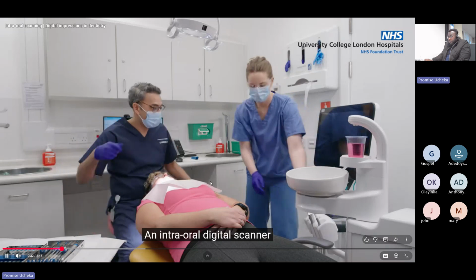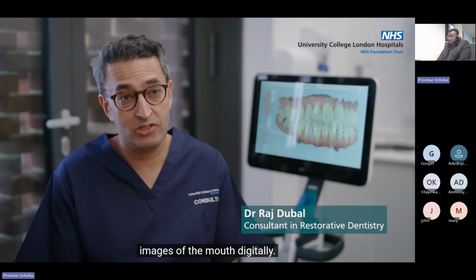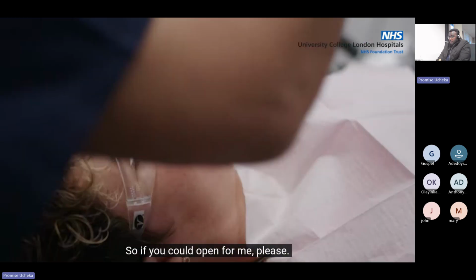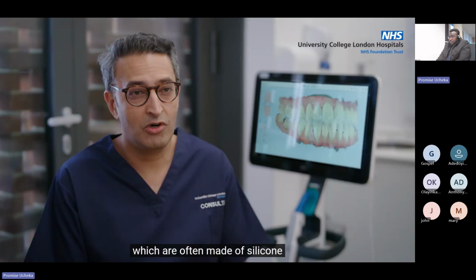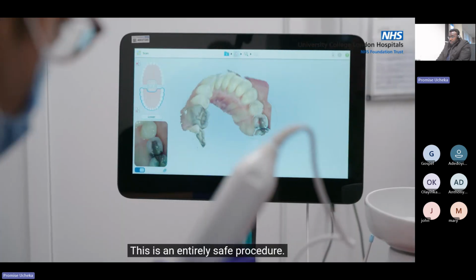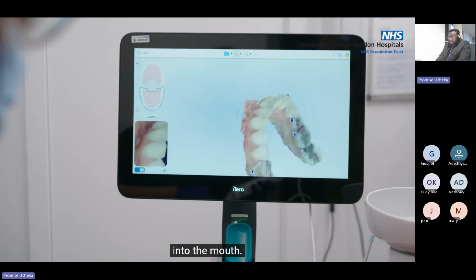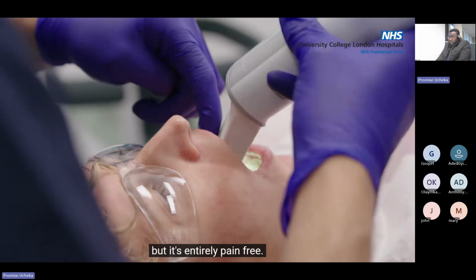An intraoral digital scanner is a handheld device which captures a sequence of photographic images of the mouth digitally, and these are stitched together to provide us with a record of the teeth, the gums, and the intraoral structures. So if you could open for me, please. These are an alternative to conventional impressions, which are often made of silicone and can be a bit messy. This is an entirely safe procedure. There's no radiation involved. It's non-invasive. Only the tip actually is inserted into the mouth.